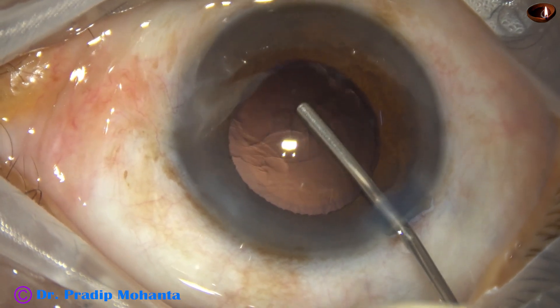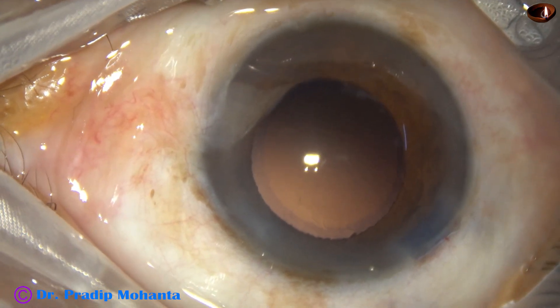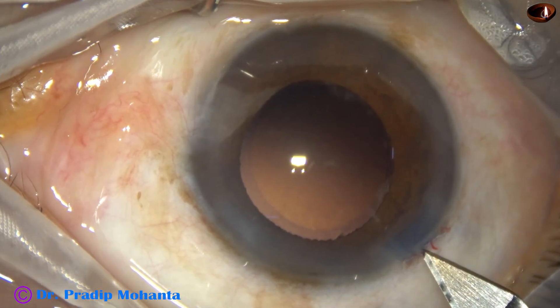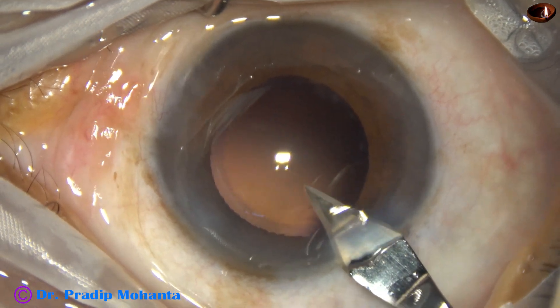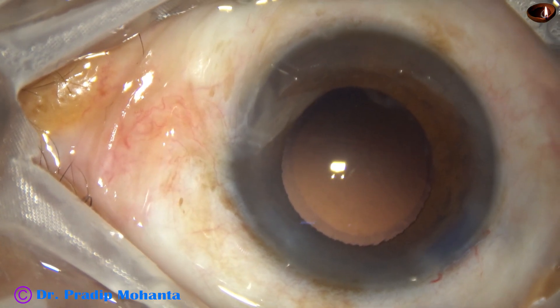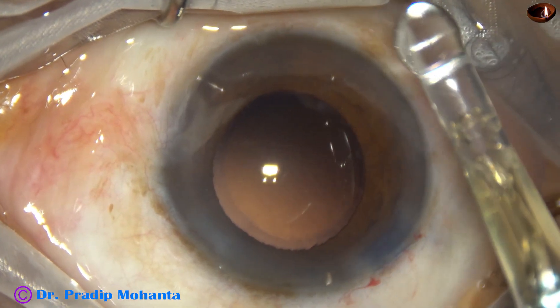There is no harm in using coaxial IA or bimanual IA — whatever you are comfortable with, you can use that; the surgeon has that liberty. I am enlarging the main incision because I am going to use a bigger injector. If we don't enlarge, sometimes the lens gets stuck at the incision.